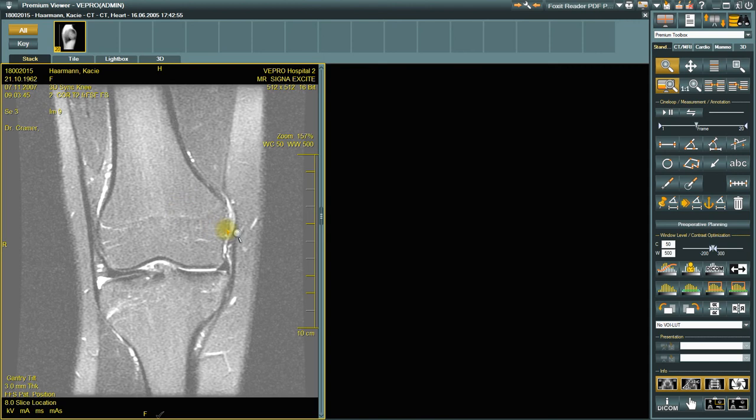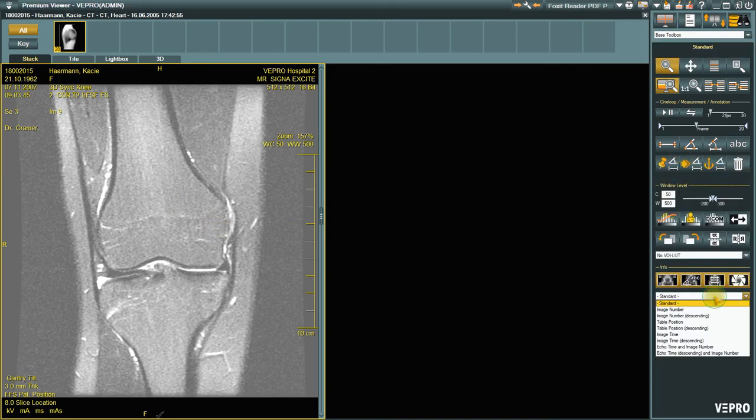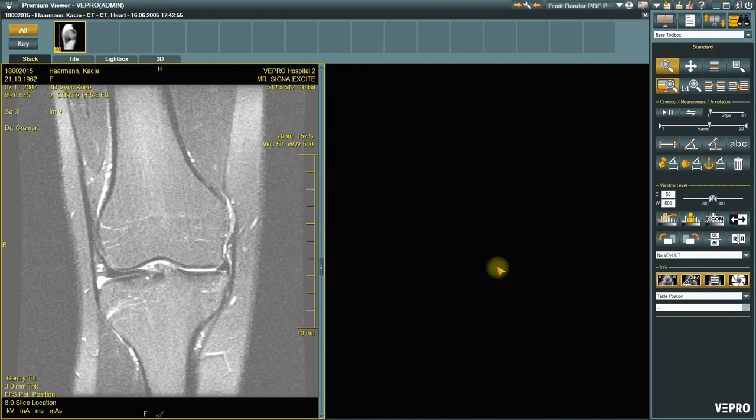You yourself can adjust the display grid, display mode and series order for any of the multitude of already pre-configured settings. These are then saved for the logged in EMR user based on the study description and modality.